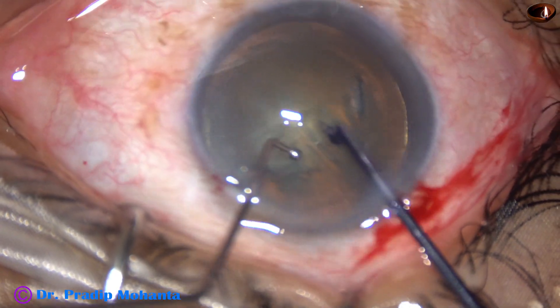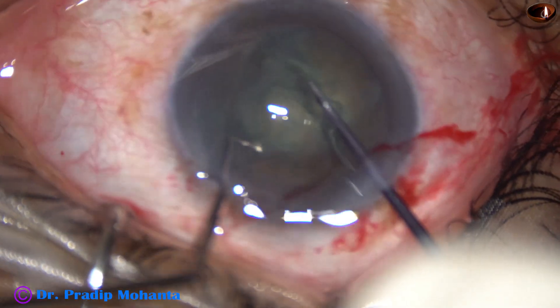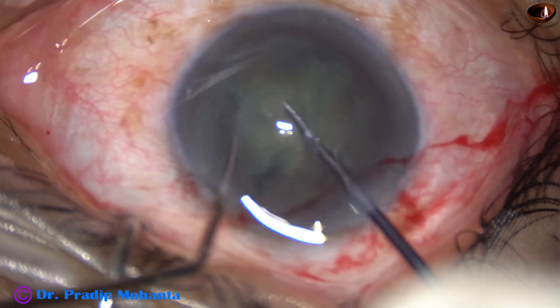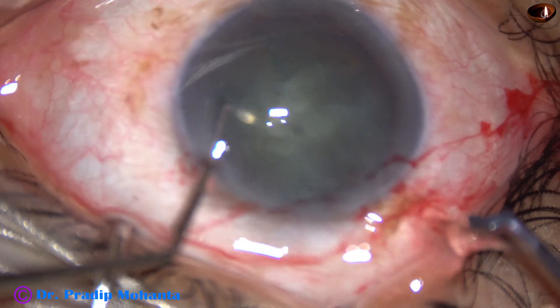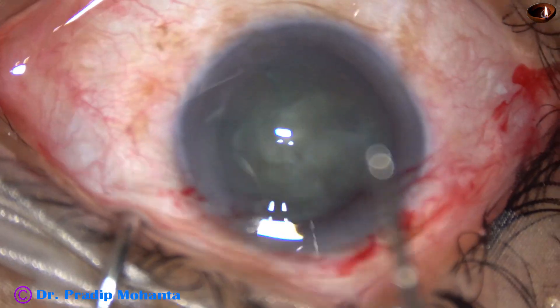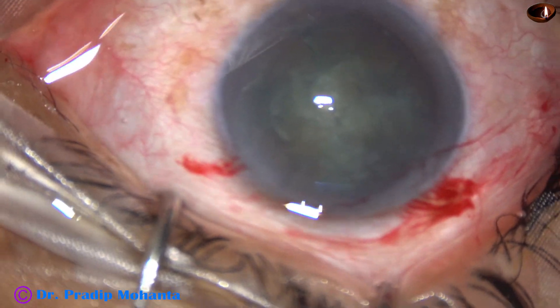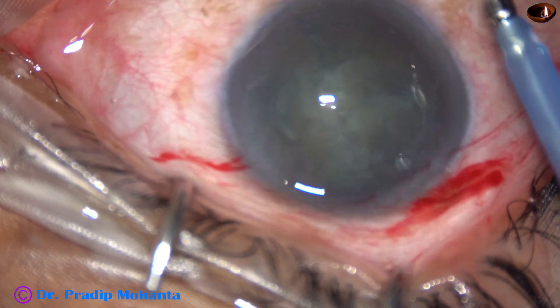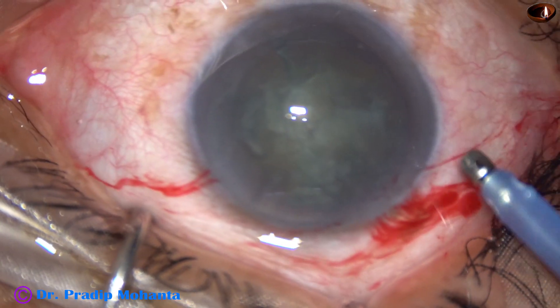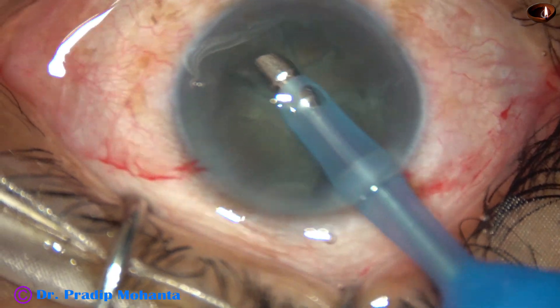In my left hand is a sustainer. The pre-chopper and sustainer are used simultaneously to divide the nucleus into pieces. For soft cataracts, it is very cumbersome to hold the nucleus with vacuum, so in such cases this pre-chopper is a game changer. I have no financial interest, but this instrument is working well.